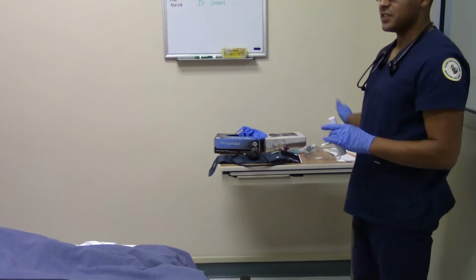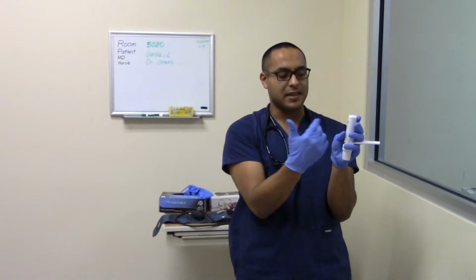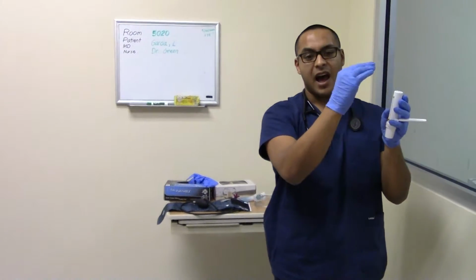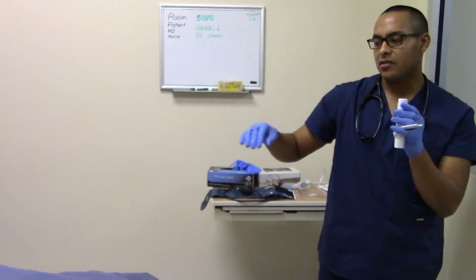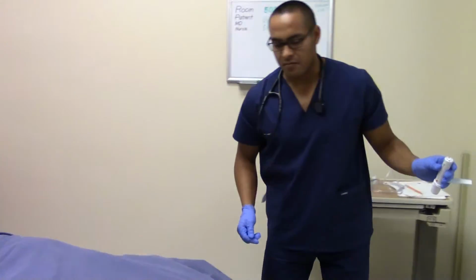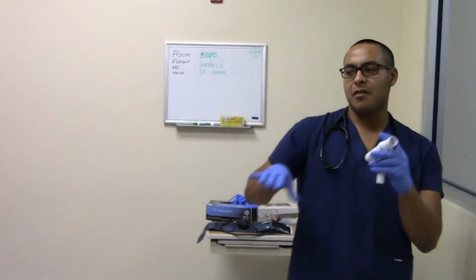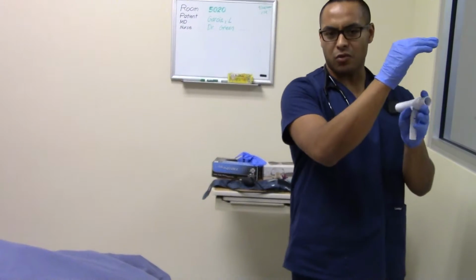Okay, so to get the percentage for that treatment, it's pretty much his number, I mean, you hit the chart, right? The chart we use, age and height. With that number, you take that number and divide it by the top number he blew out. I went to patient mode right now. I'm back into the camera mode. So you take the best one out of 3, the strongest one, 300, 350, whatever, divided by what they were supposed to get.